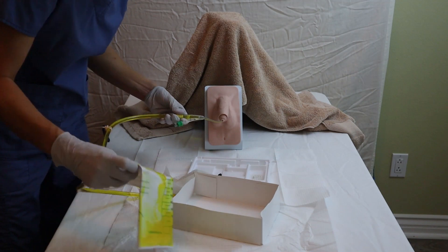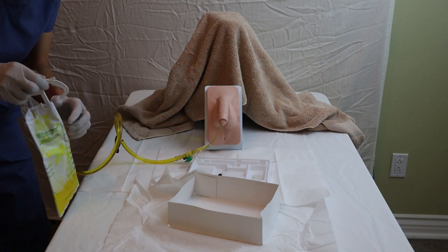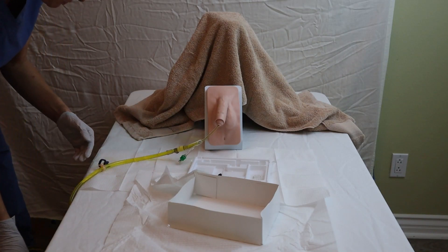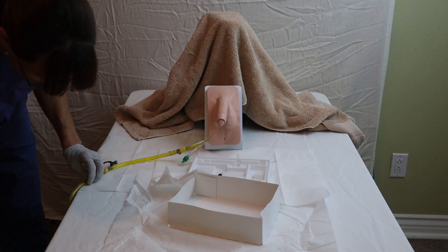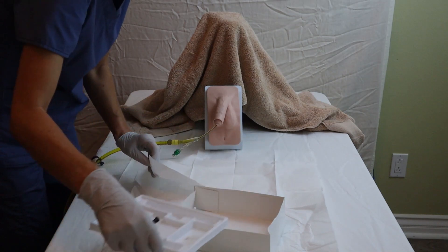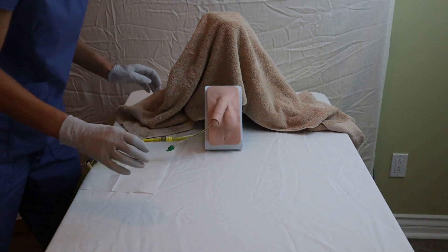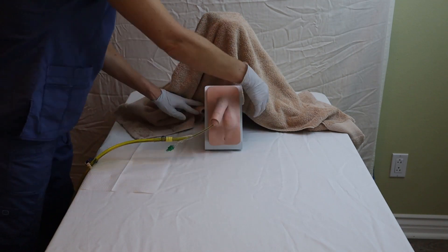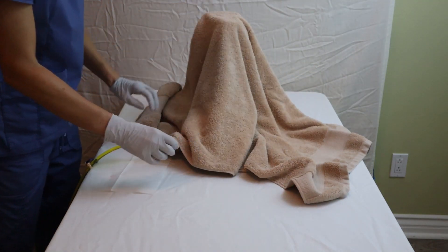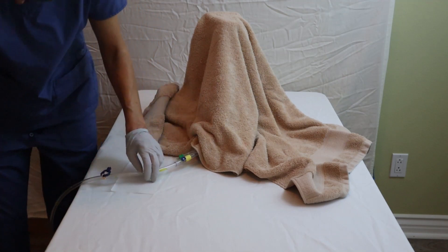As I lower the catheter it will fill with urine. I attach the catheter bag with its hook to a non-movable part of the bed — usually a hook on the bottom — and then wait until it stops draining. In the meantime I can gather my equipment and throw away what I no longer need. I take care of my patient, make sure they are comfortable, and provide privacy. At this point I no longer need to assess their genitals, but I want to assess their urine output — and as you can see it has now stopped flowing.